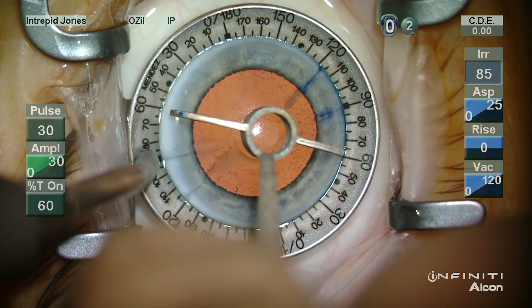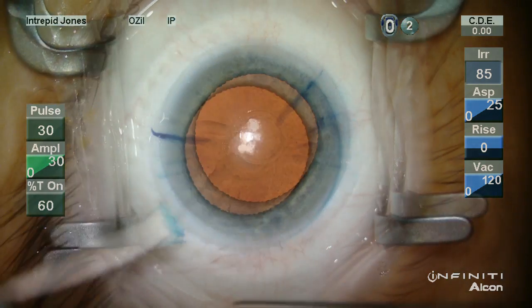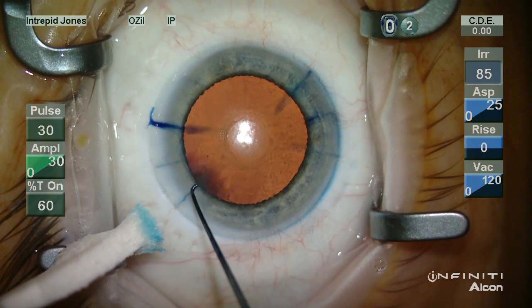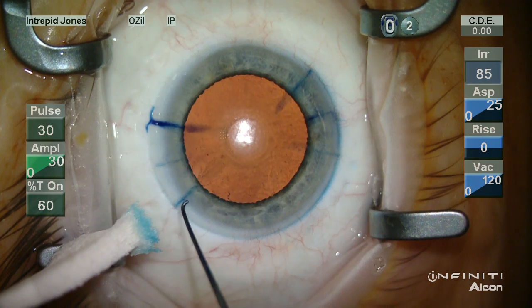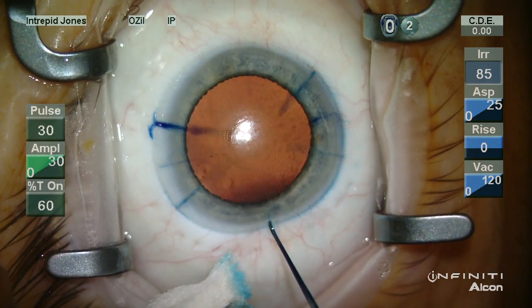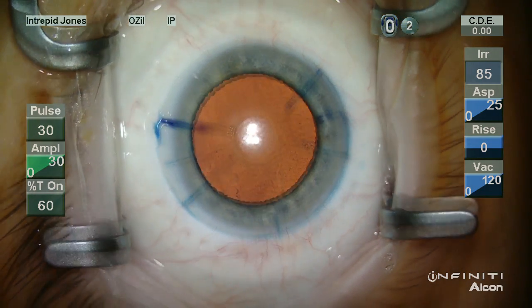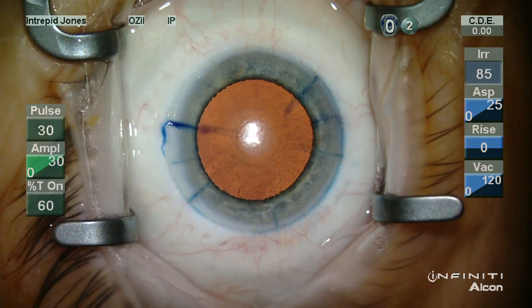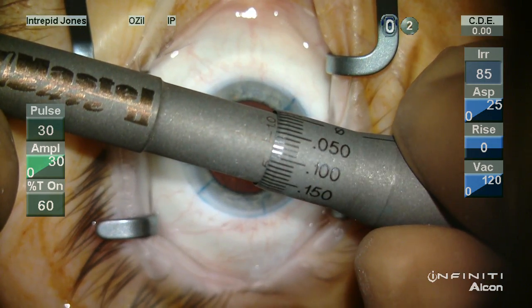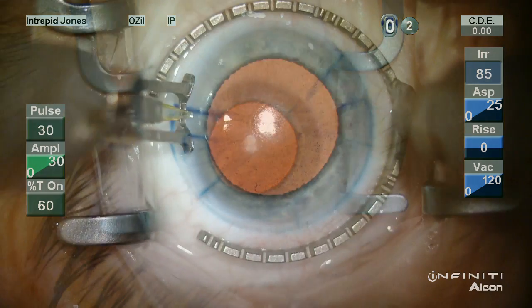It's very helpful to look for symmetry of your marks to ensure that you have actually marked off all these accurately. I will often touch up these marks with additional methylene blue using a Sinski hook. The methylene blue is obtained from Hurricane Medical and gives a long-lasting effect, certainly adequate for these procedures. Once again you need to check the reference zero mark and then rotate the barrel up to the desired depth.